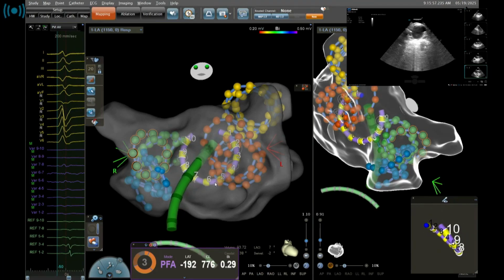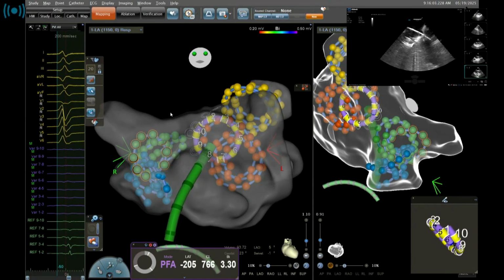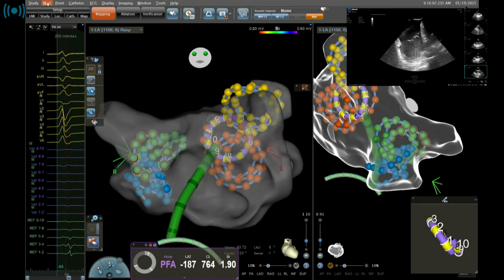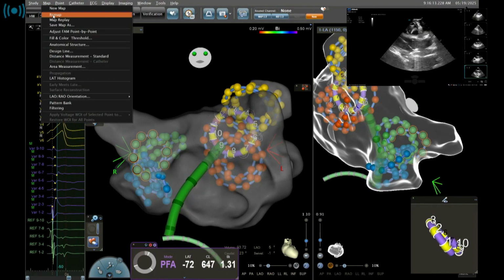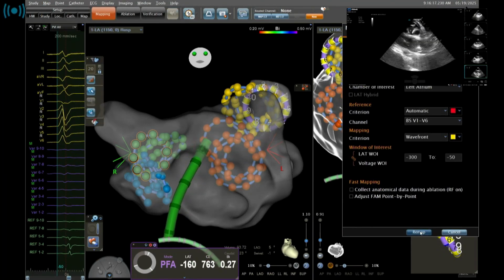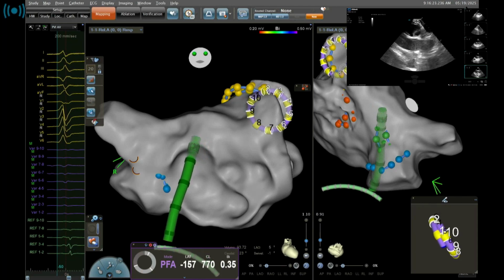So you have about 5 more minutes. We can do the remap, or if you want, we can wait and do the remap after the waiting period, as you prefer. Well, we can do the map now. Okay, then I basically start. You're done. Excellent. Very good. So we will then switch to Homolka for the next case.